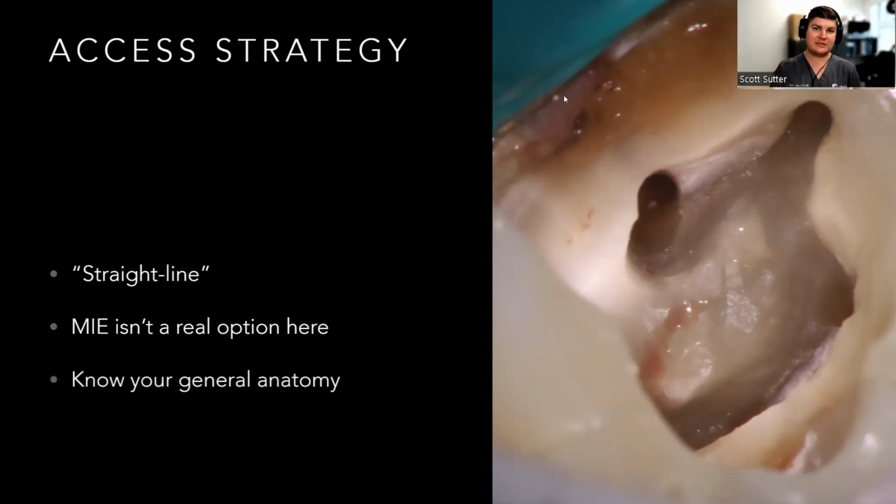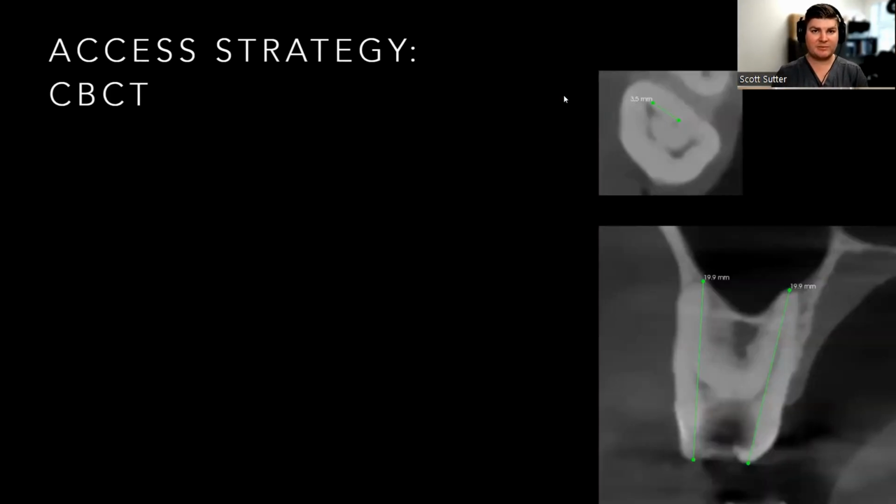Now, that being said, know your general anatomy. This is where the cone beam comes in so much. I take cone beams on all my patients, and I really encourage you to do this once you get out into the real world. I know it's hard right now with the school, but cone beams are so, so useful.